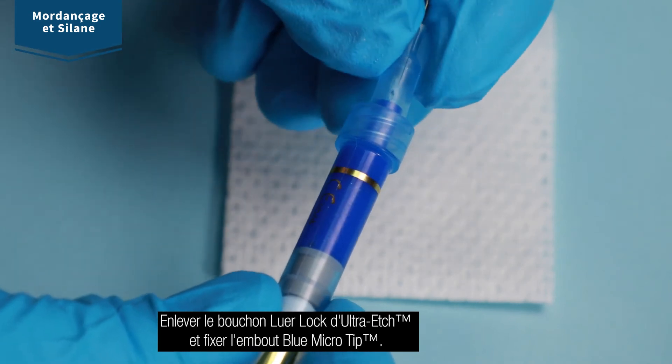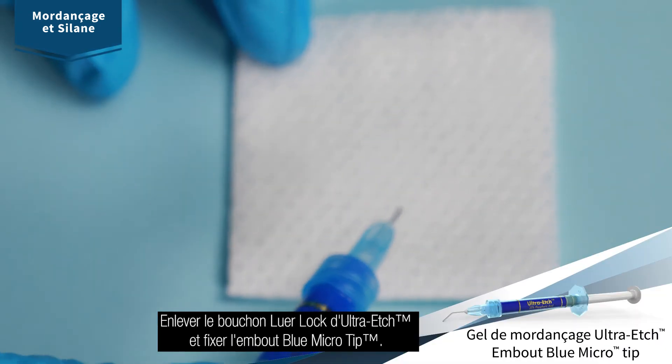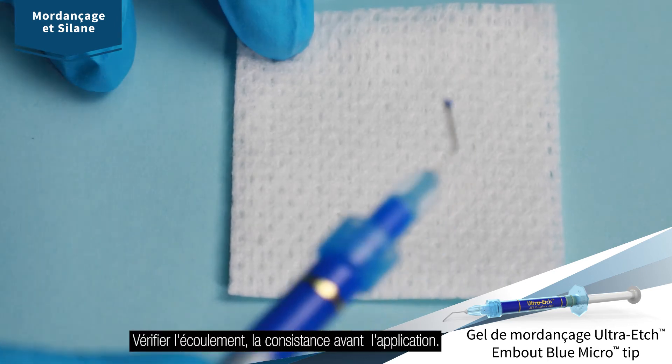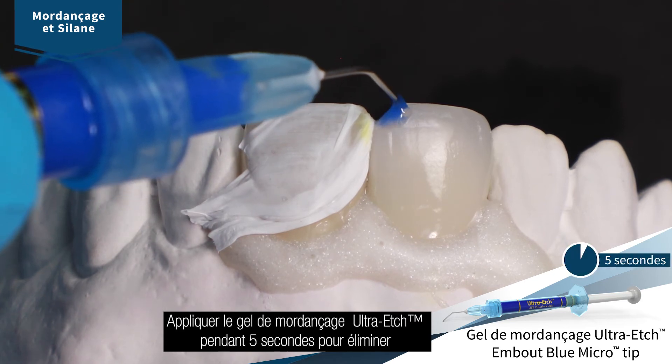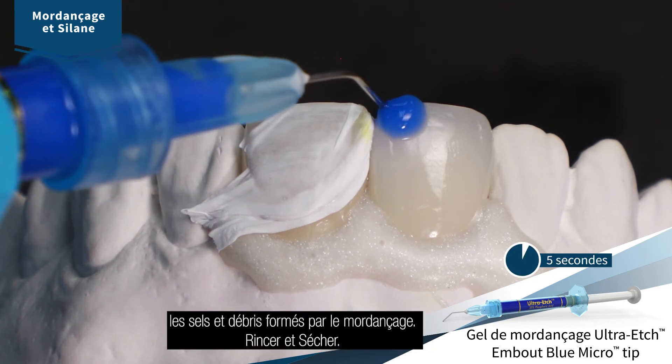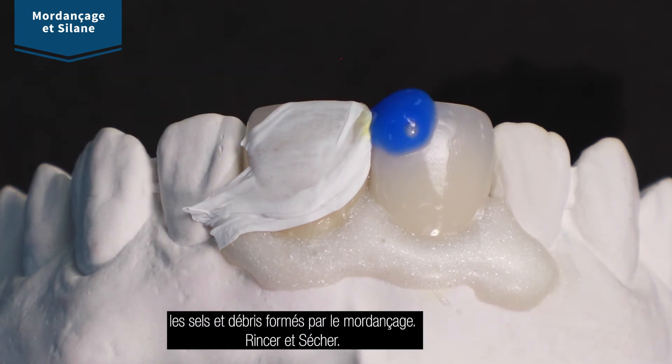Remove luer lock cap from ultra etch etchant and securely attach blue micro tip. Verify flow before applying. Apply ultra etch etchant for 5 seconds to remove porcelain salts and debris formed by the hydrofluoric etchant. Rinse and dry.